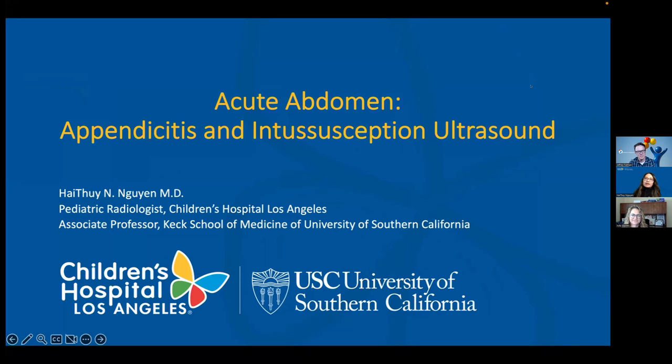This is going to be kind of a start, a mini series on the acute abdomen using ultrasound, or evaluating the acute abdomen using ultrasound. I'm going to start off with something fairly bread and butter. Hopefully I'll sprinkle a little bit of seasoning in there to whet your appetite.